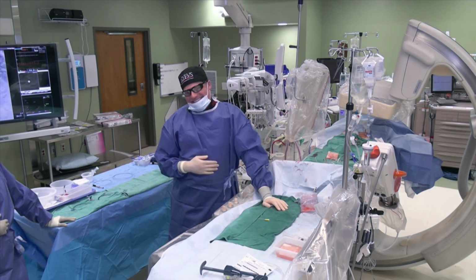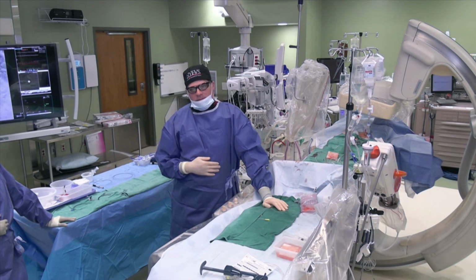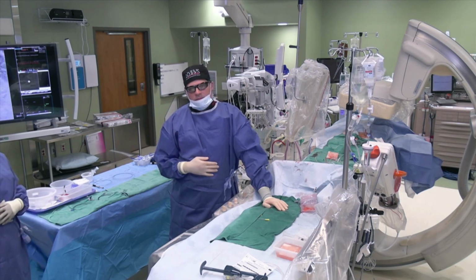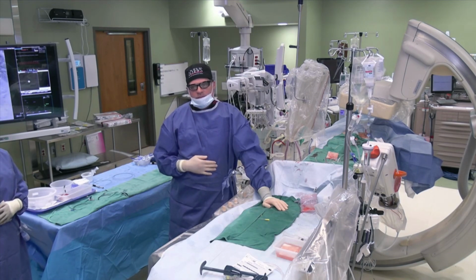George, you're a brave man to take on these cases with no upfront imaging, but that was a very challenging case, and I like the way that you managed the trifurcation. You were able not to leave anything behind there using that drug-eluting or drug-coated balloon approach and having access into both of those vessels. So that was nicely done.